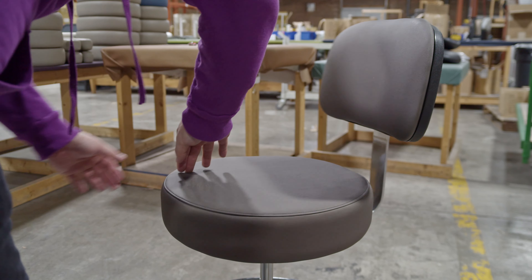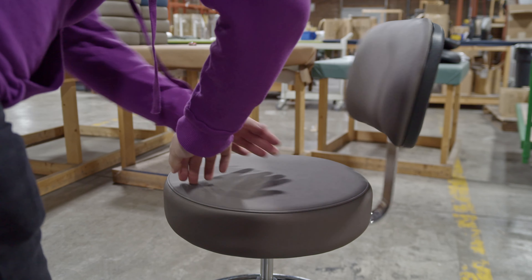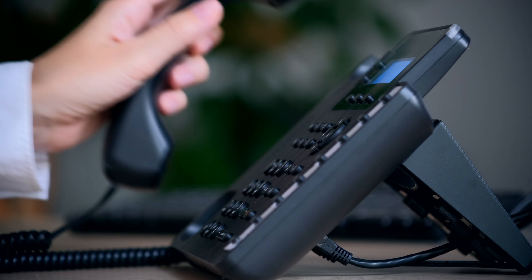Examine the physician's stool and all components for nicks, dents, scratches, or other damage. If damage is evident, notify the carrier and Graham-Field.